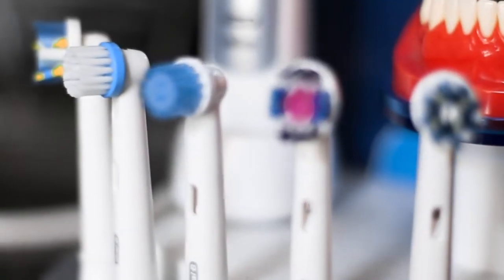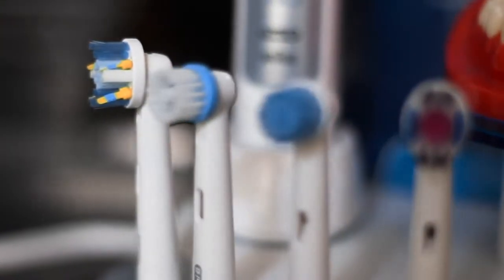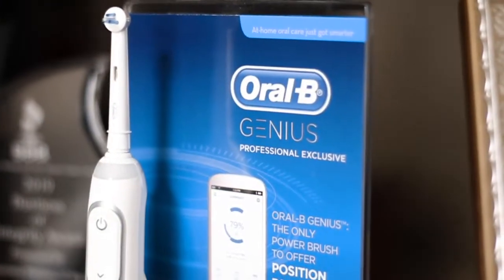It comes with five different brush heads. One of the brush heads is very small and can reach all the way back to your molars when you're relaxing your cheeks. It goes all the way back and even wraps around that second molar so you don't have any plaque buildup in the back.